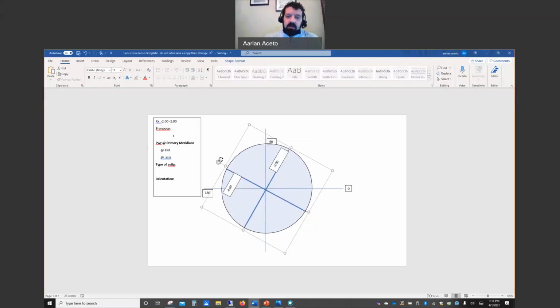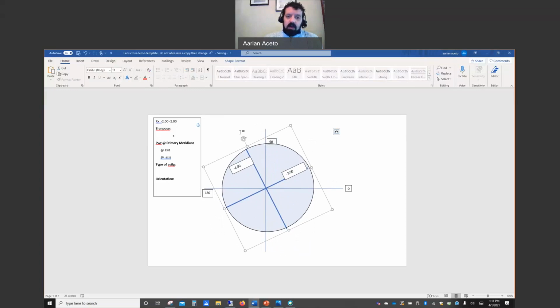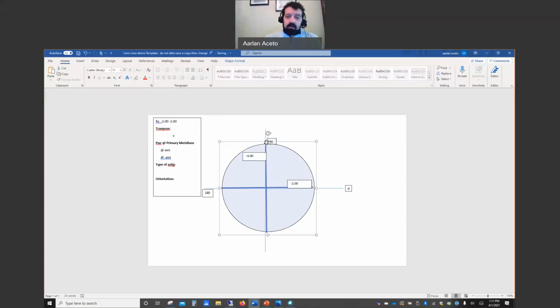Well, what's interesting is notice how, if this amount of astigmatism that we have was caused by differences in corneal curvature, here's my -2 here, here's my -4. One of the things that causes more myopia is a steeper cornea. So let's say the eyeglass prescription was like this. I have a -2 back and forth, and a -4 up and down.